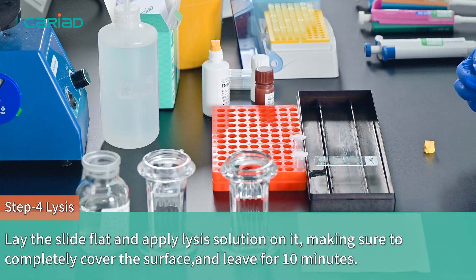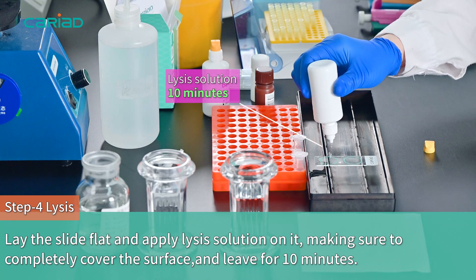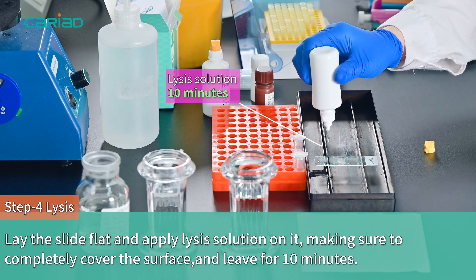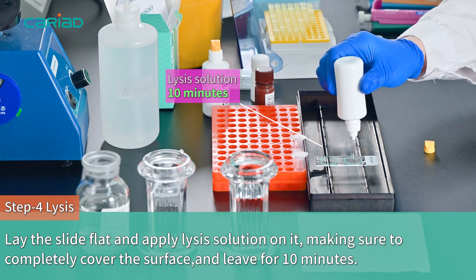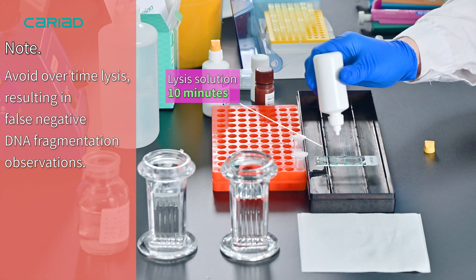Step 4. Lay the slide flat and apply lysis solution on it, making sure to completely cover the surface, and leave it for 10 minutes. Note: avoid overtime lysis, resulting in false negative DNA fragmentation observation.